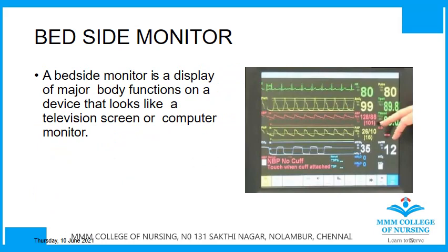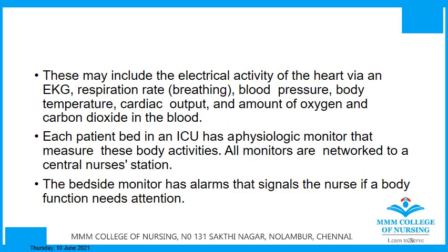Bedside monitor. The bedside monitor is a display of body functions on a device that looks like a television screen or a computer monitor. This is a cardiac monitor where you can see the entire details of the patient. This may include the electrical activity of the heart via an EKG, respiration rate, blood pressure, body temperature, cardiac output, and the amount of oxygen and carbon dioxide in the blood.